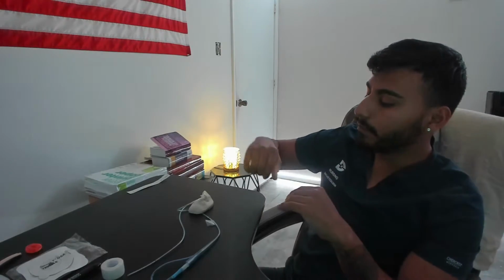So now I can go into the patient's room. Mr. Buzzard, can I have you verify your name and your date of birth? Awesome. Now can I look at that wristband for me? So I verify with that wristband. Okay, let's get started. I put the bed to a working height, high Fowler position, and lower the side rail down. Again, dominant hand closer to the patient.